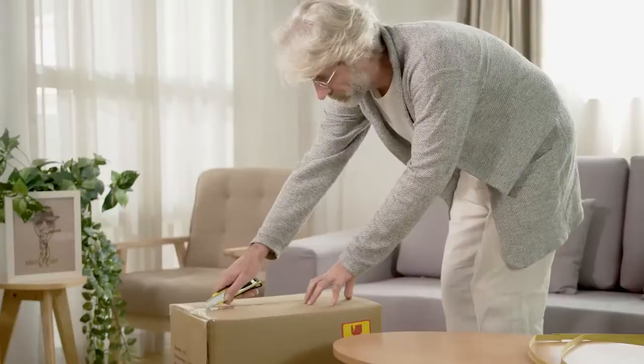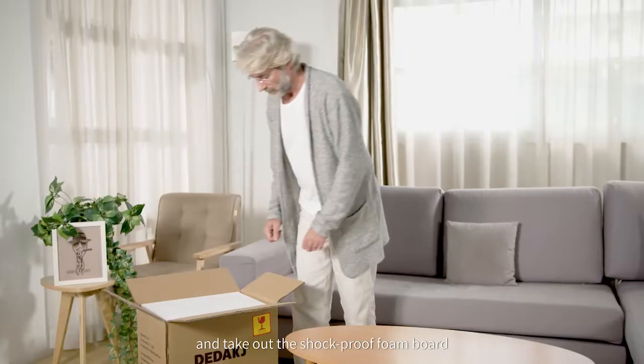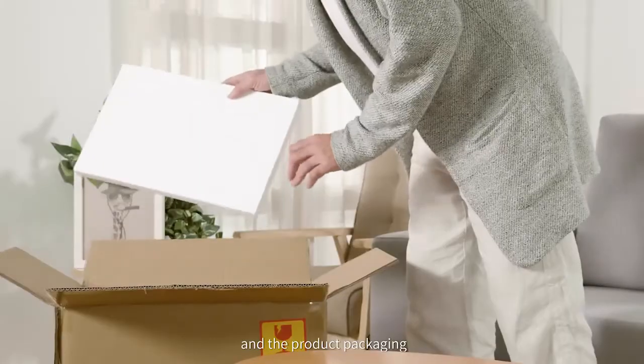First, cut the strapping band. Then, cut the sealing tape and take out the shockproof foam board between the courier box and the product packaging.